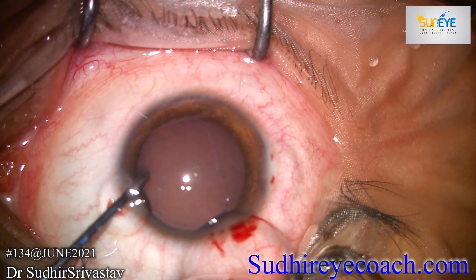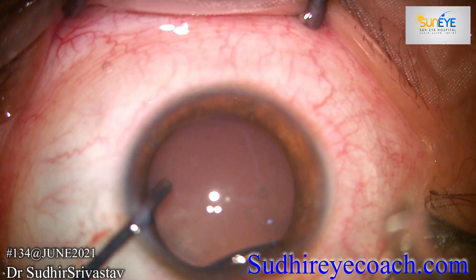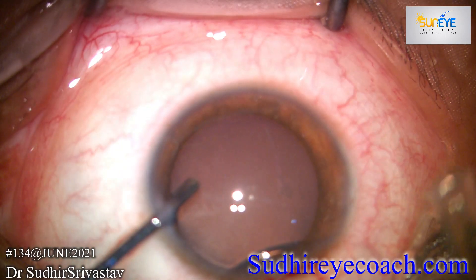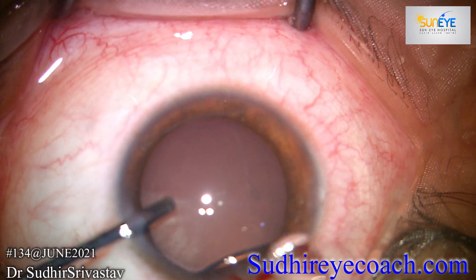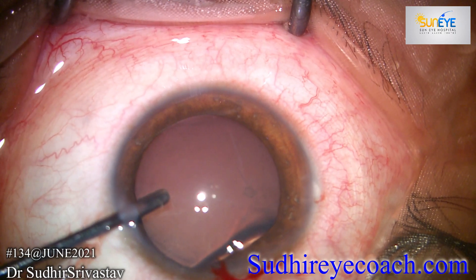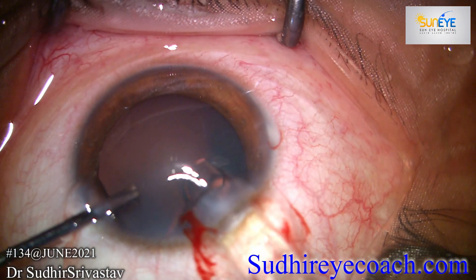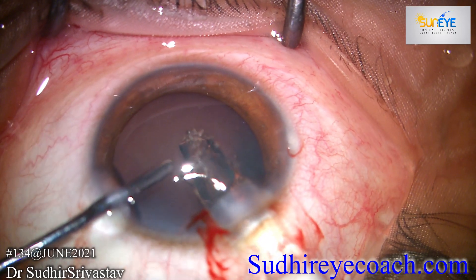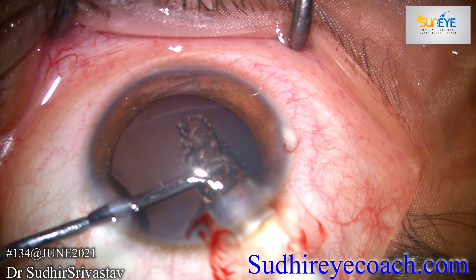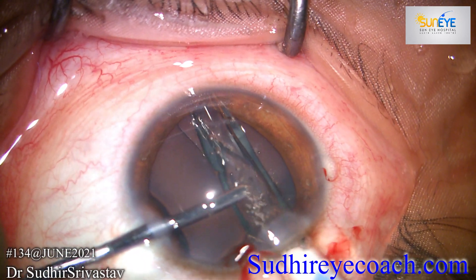I always use a blunt thick iris repositor in my second hand to hook the eye and for the ICL manipulation during its entry inside the anterior chamber. The cartridge tip was inserted inside the chamber and gradually the lens was injected inside the eye. With the second instrument I guided the lens and kept it away from the cornea.